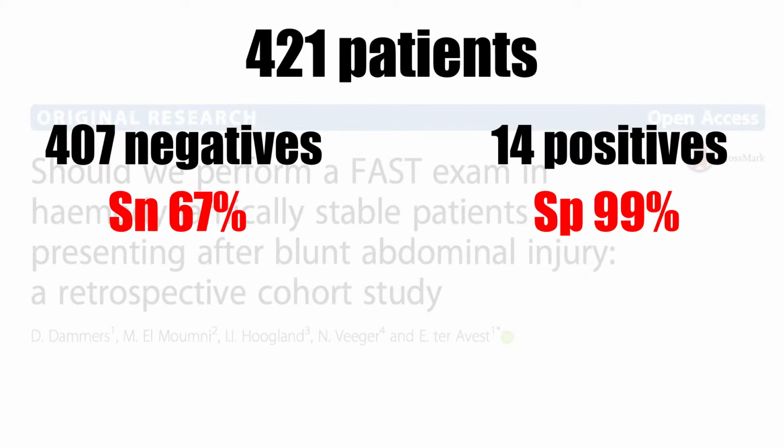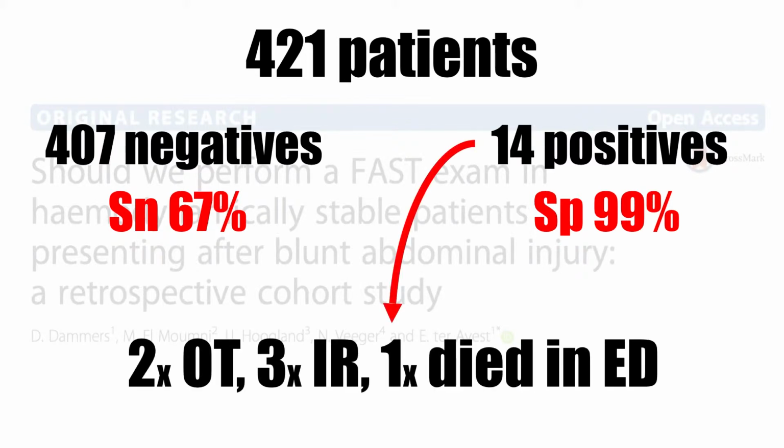In this study, I'm more interested in this positive group, you see, because out of these 14 patients with normal vital signs and a positive scan, 2 went urgently to theatre for a laparotomy, 3 went to interventional radiology for urgent angioembolization, and 1 poor patient died in the emergency department before definitive care could be arranged.